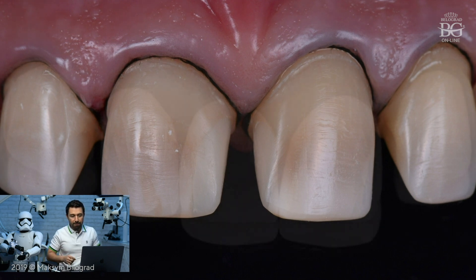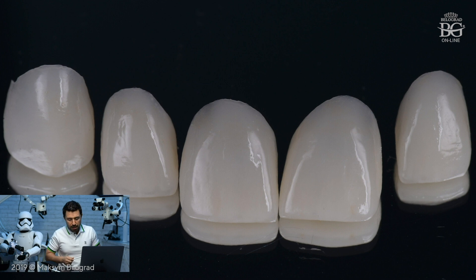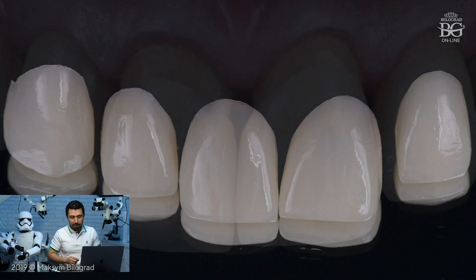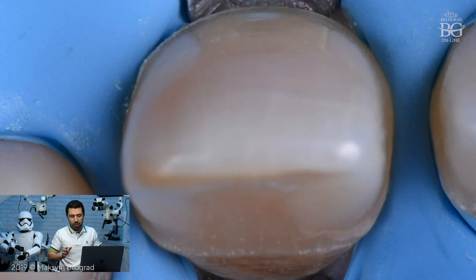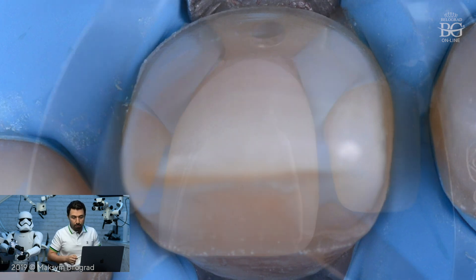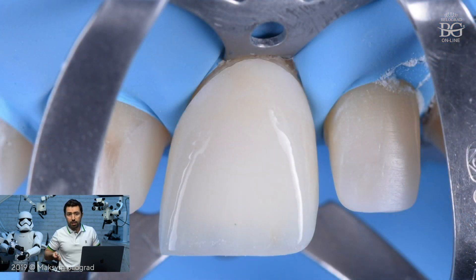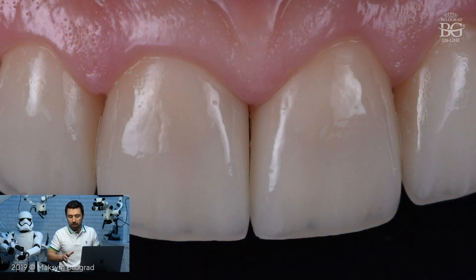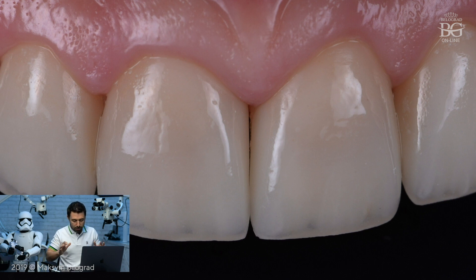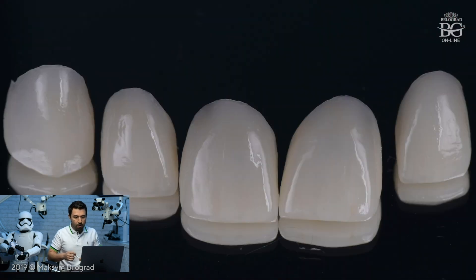These are the final preparations. The ceramic crowns were made of IPS e.max with slight cutback and layering. You can see the try-in, the palatal view of the prepared tooth showing truly minimal preparation, and a dry fit control with no bonding or cement yet showing excellent fit. Immediately after cementation, the soft tissues look perfect — everything is okay.